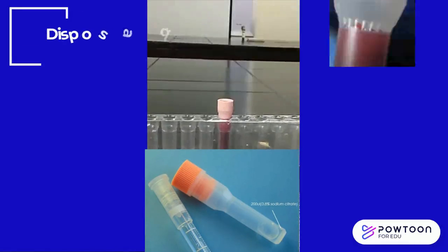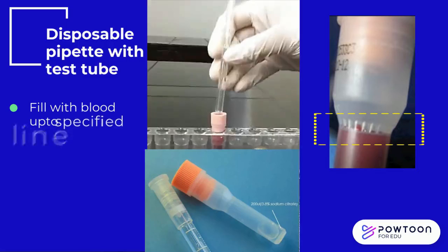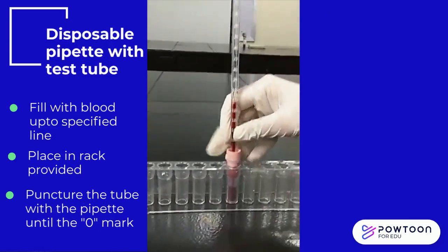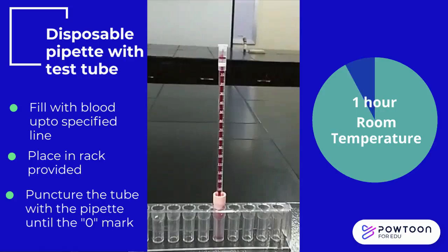For the second type of disposable tube, blood is collected into the specified line of the tube and placed on the rack provided. Puncture the tube with the ESR pipette and push down until blood reaches the zero mark. Let it stand undisturbed for 1 hour.